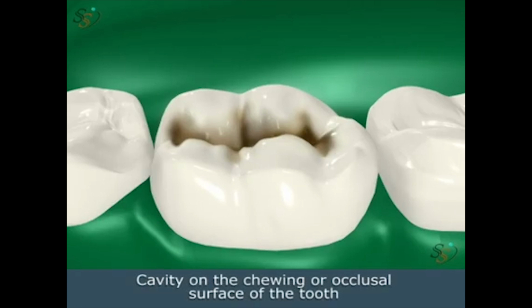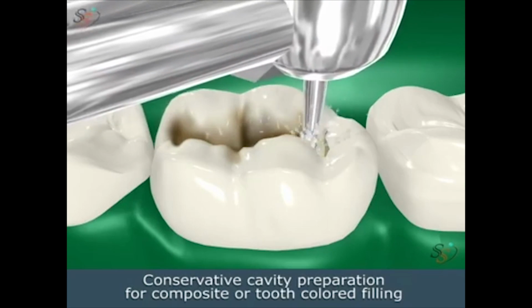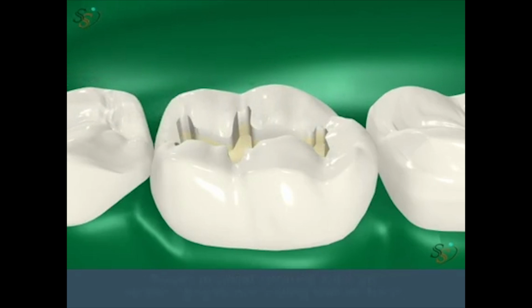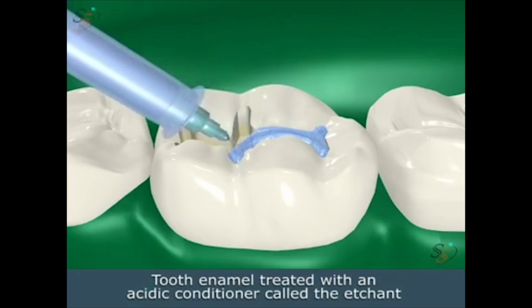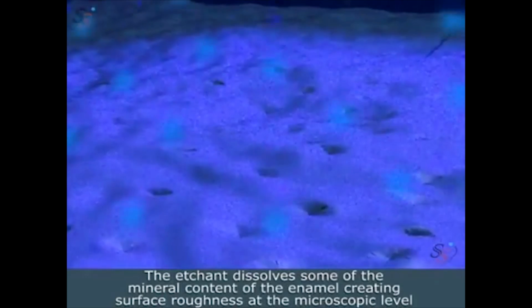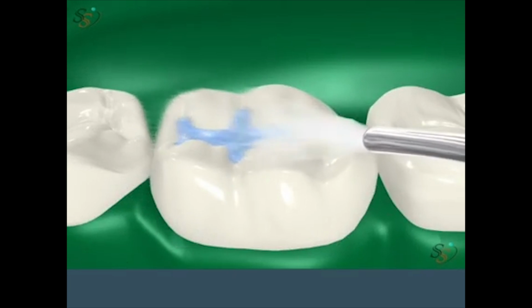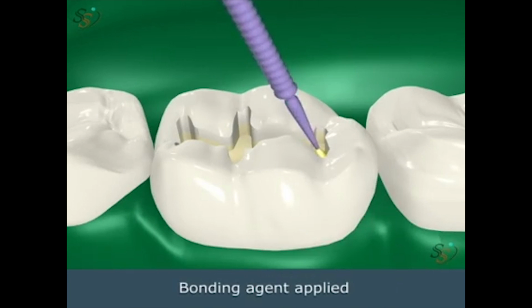When a cavity on the chewing or occlusal surface of the tooth is evident, a filling is needed. Tooth enamel is treated with an acidic conditioner called etchant. The etchant dissolves some of the mineral content of the enamel, creating surface roughness at the microscopic level. A frosted glass appearance of the treated surface appears after the etchant is introduced.